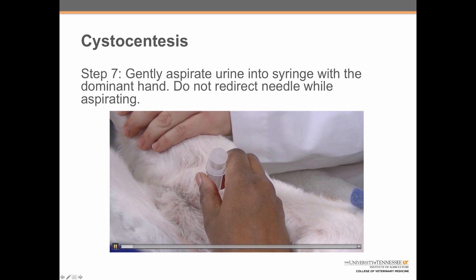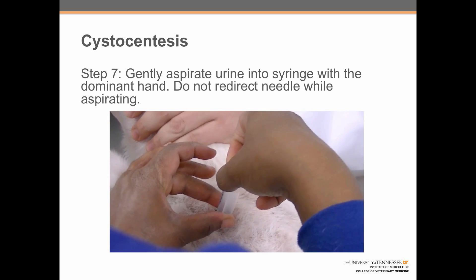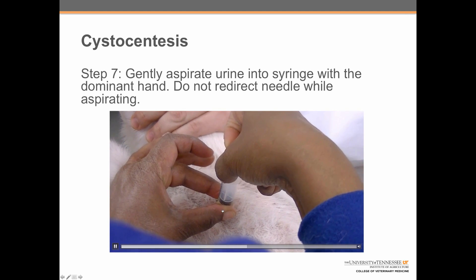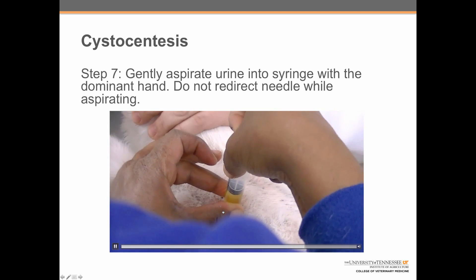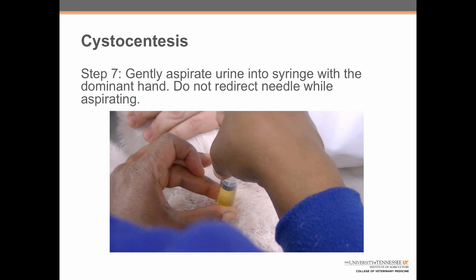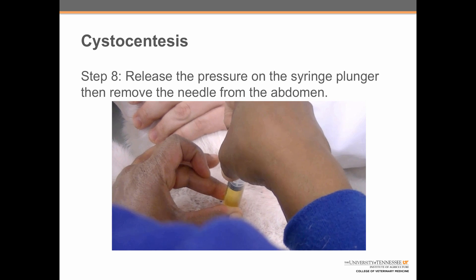Step seven: gently aspirate urine into the syringe with the dominant hand. Do not redirect the needle while aspirating. Luciana is using her non-dominant hand to hold the syringe stable so that the needle doesn't move around, being very careful not to redirect the needle. Finally, in step eight: release pressure on the syringe plunger and then remove the needle from the abdomen.